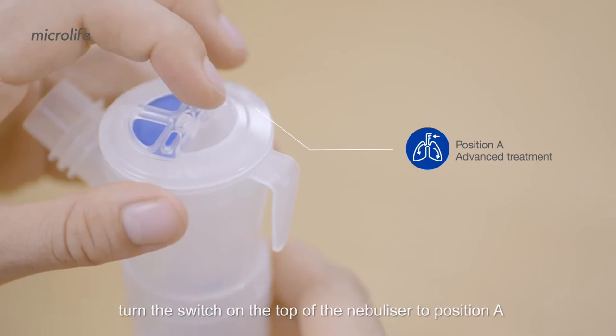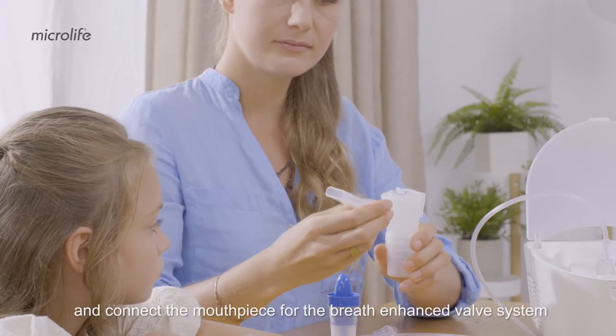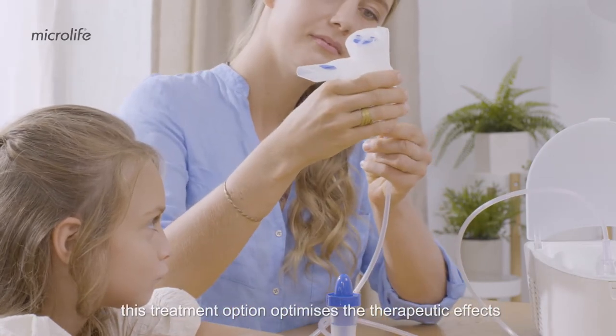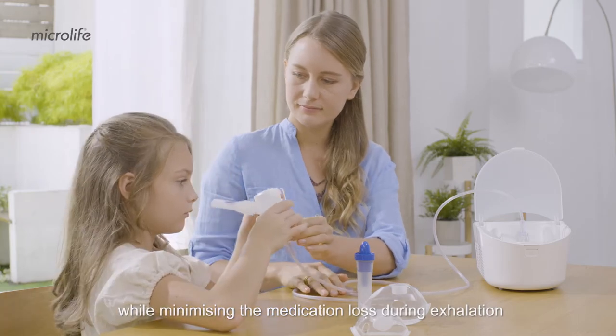Turn the switch on the top of the nebulizer to position A and connect the mouthpiece for the breath-enhanced valve system. This treatment option optimizes the therapeutic effects while minimizing the medication loss during exhalation.